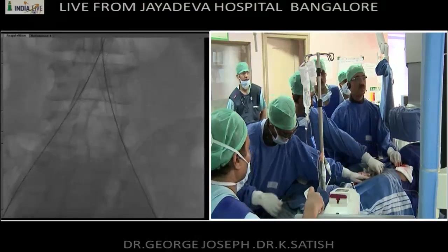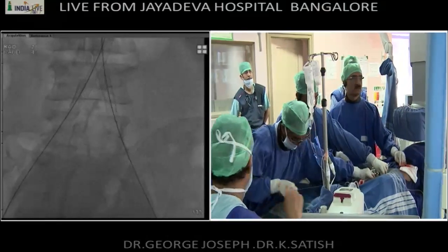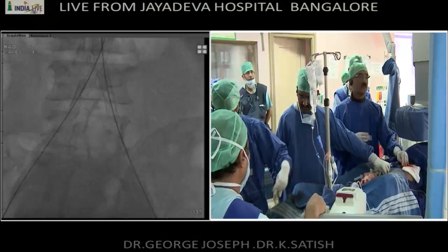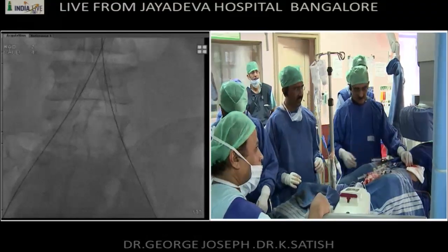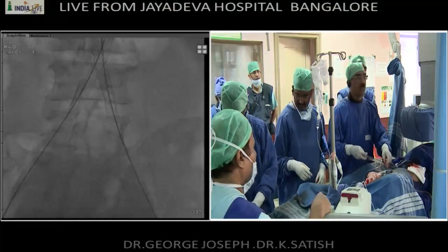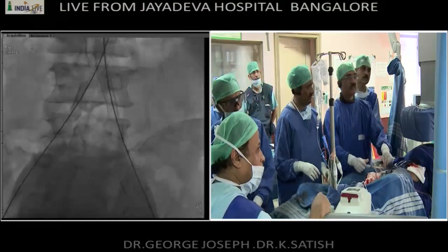You have a 6 balloon? We have a 640, no? So we have deployed a self-expanding stent on the left side, and I'm going to just expand it a little bit with a 6 mm balloon.